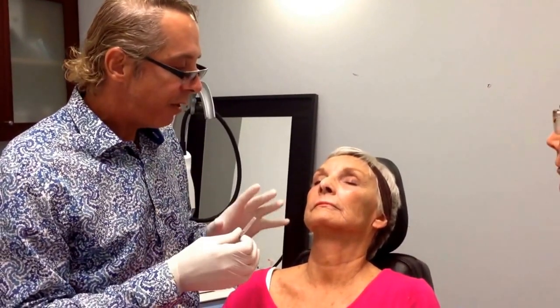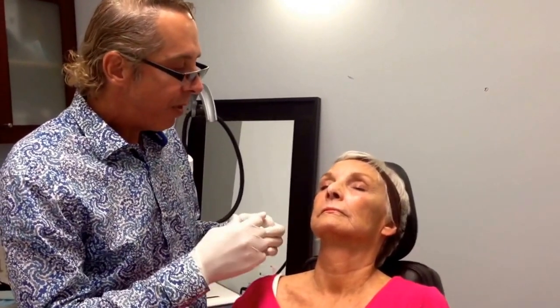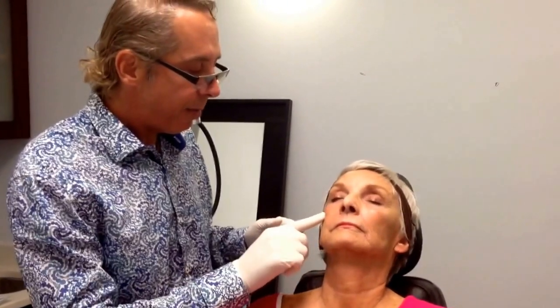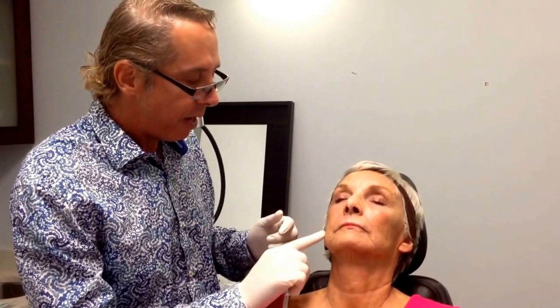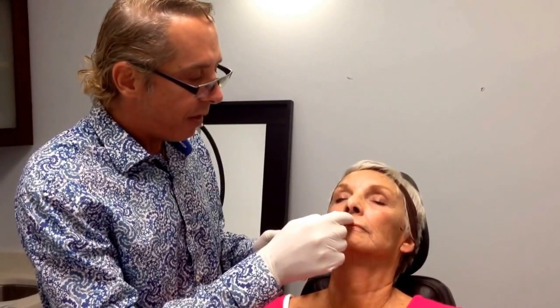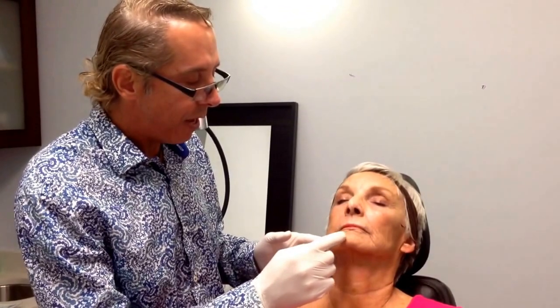What I'm going to do is use a cannula to do this. We block the trigeminal nerve — the temporal zygomatic, the temporal nerve, the great auricular nerve, the cervical contributions that are here. You have the nasal branch contributing to the upper lip, and then you have the mental nerve down here. So we do blocks and not too messy.